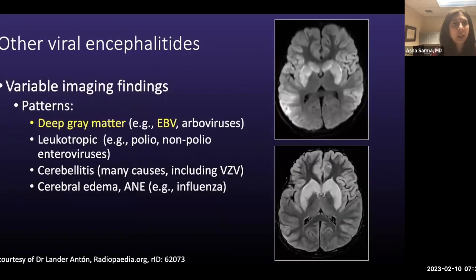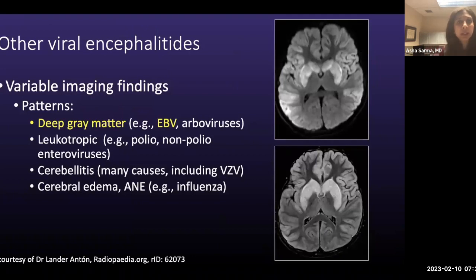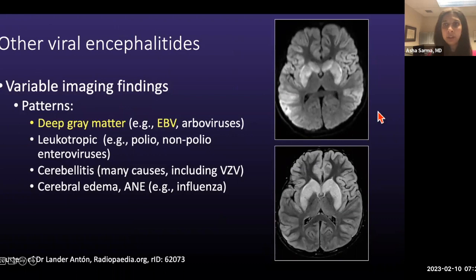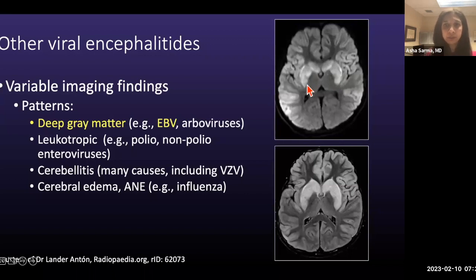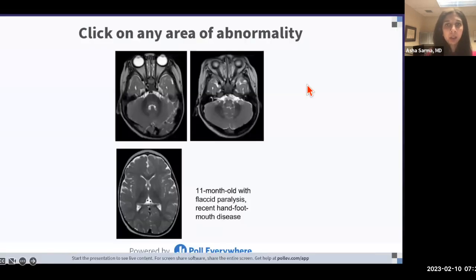Moving to other viral encephalitis: when there is symmetric involvement of the deep gray matter, as in this case posted on Radiopaedia, Epstein-Barr virus infection can produce a pattern like this. Arbovirus infections can also cause this pattern.